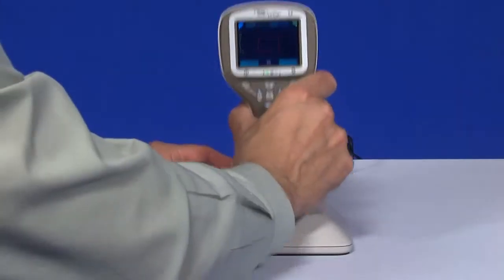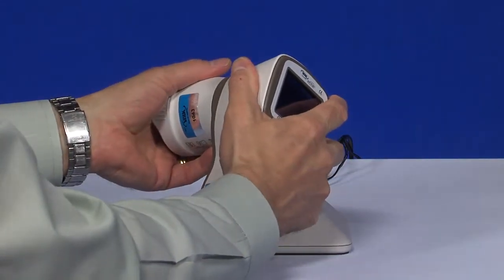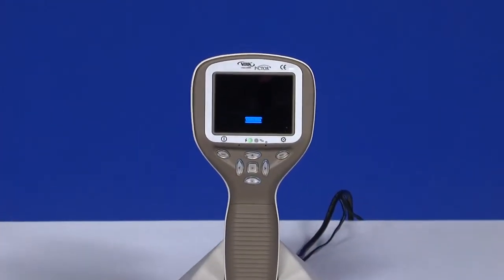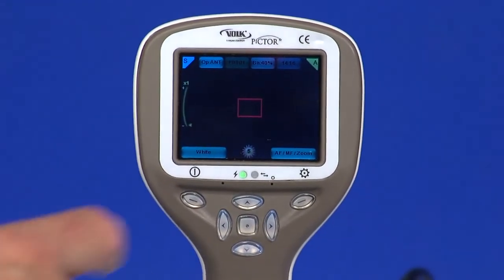Let's go through the steps for using Pictor with the anterior attachment. Attach the anterior module to the Pictor camera. The light source is chosen by pressing the left soft key.